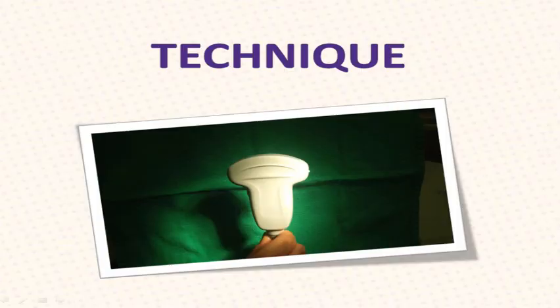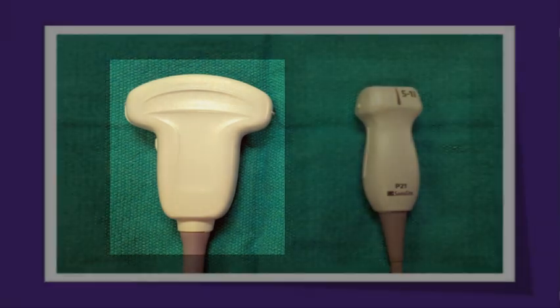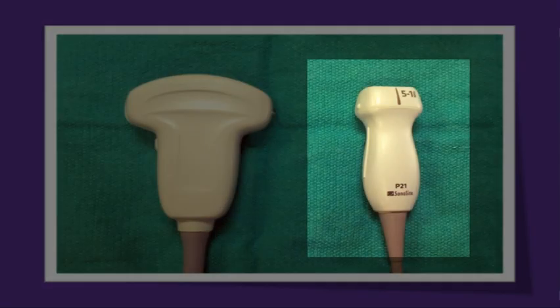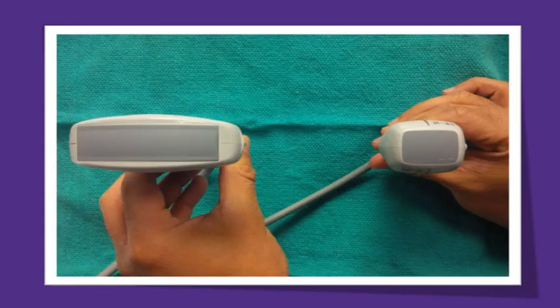Now let's move on to the actual hands-on technique in generating these images. As with all of our basic applications, this point-of-care aorta assessment can be done with either the curvilinear or the phased array probe. Either of these probes can be selected from the Triple Connect system on all of our Sonosite units. As you begin your training, you may find the curvilinear probe a bit easier to use.